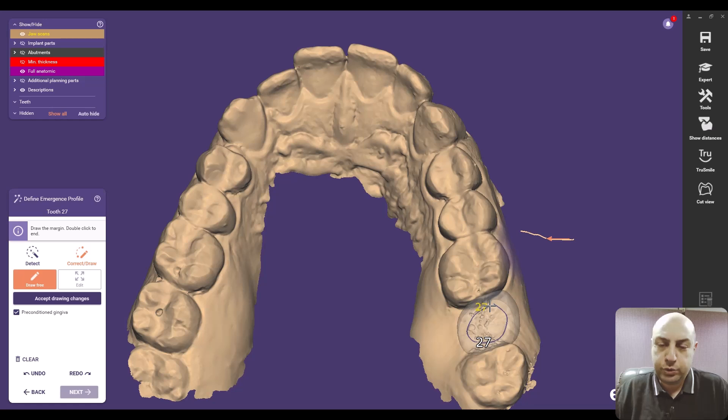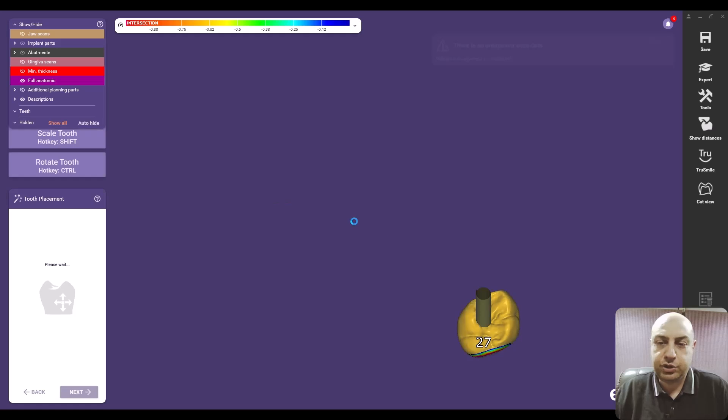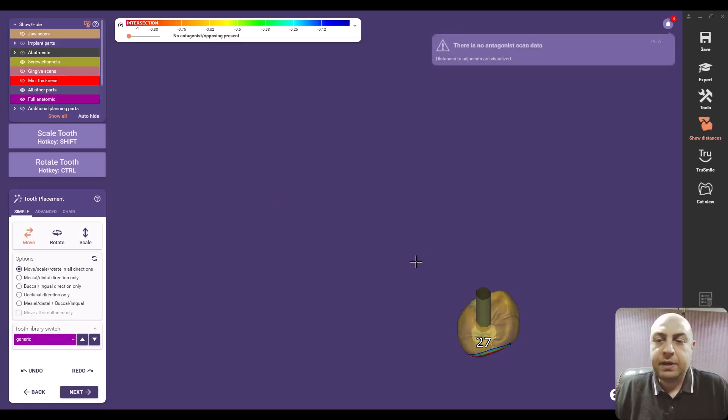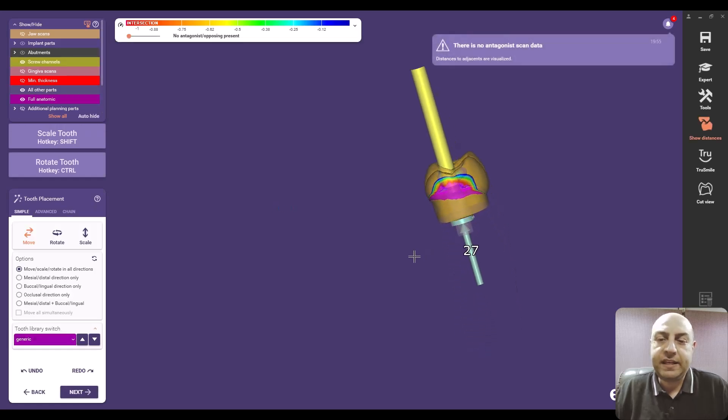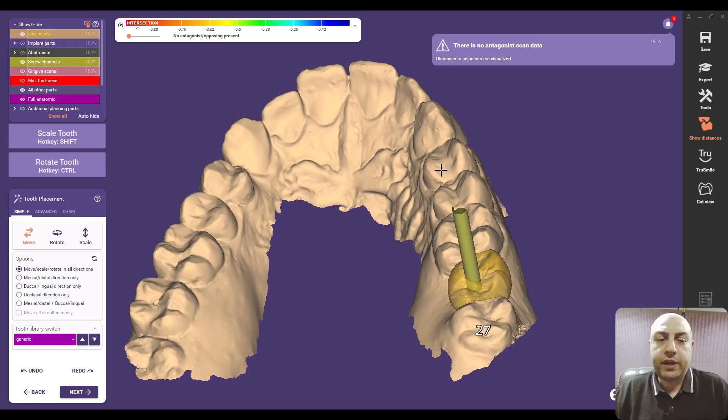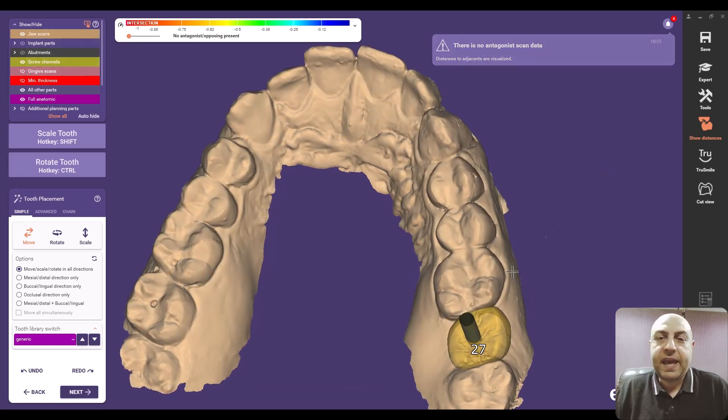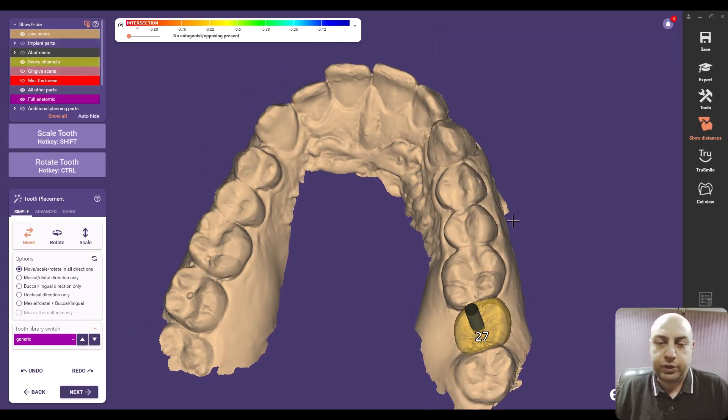And from there we can go on and on to design a restoration. I will not go through designing a restoration through Exocad because this needs another course, it's a huge topic but for now you know how to link Exoplan to your Exocad and start doing immediate load restoration.